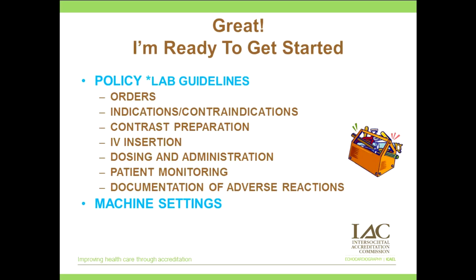And as I mentioned previously, if you do not already have a contrast setting, contact your system application specialist and get one in your machine. All it would be then is just a press of a button. And artifacts: how to identify them, what they are caused by, and also how to avoid them. I know that this is a lot of information, but I really think that now that you are aware of all these components of contrast-enhanced imaging, the process will run smoothly and efficiently.